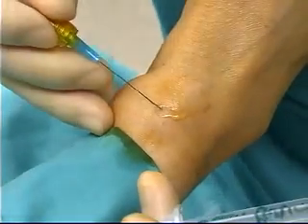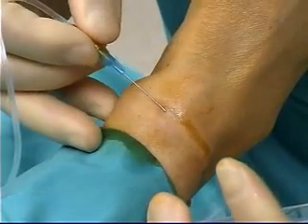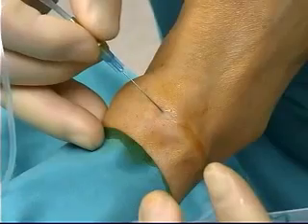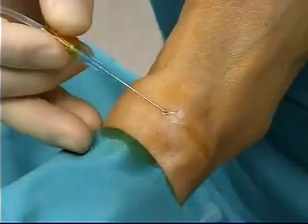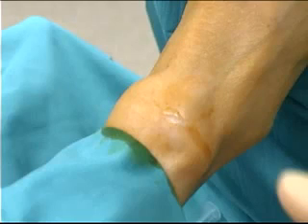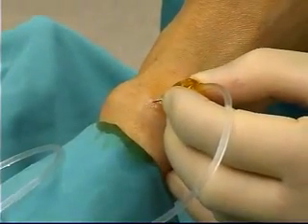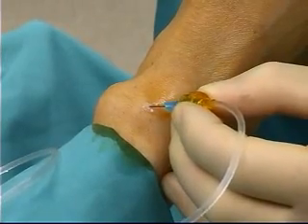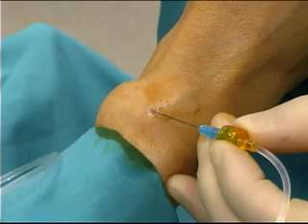Without leaving the skin with the needle, it is now directed laterally between the skin and fascia layer towards the fibula. Note the skin wheal that is raised during injection, which indicates that the injection is subcutaneous yet superficial to the fascia. Intradermal injection, like injection deep to the fascia, will lead to failed block. Direct the needle medial and subcutaneously towards the anterior aspect of the medial malleolus and observe the skin wheal while injecting on the saphenous nerve subcutaneously and superficial to the fascia around the saphenous vein.